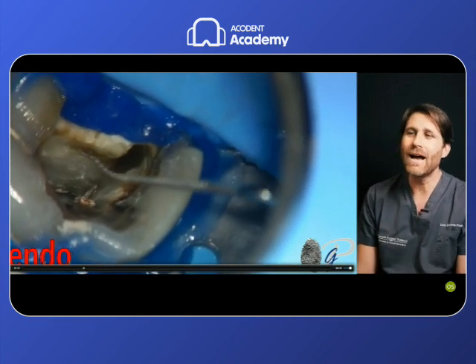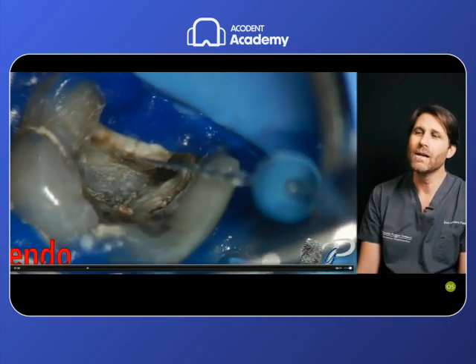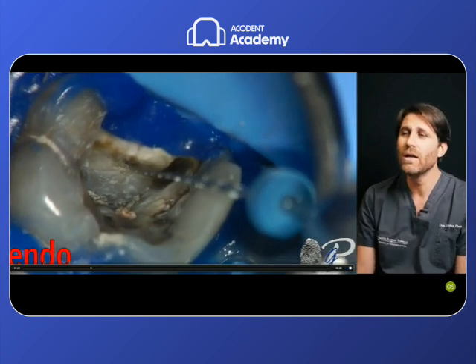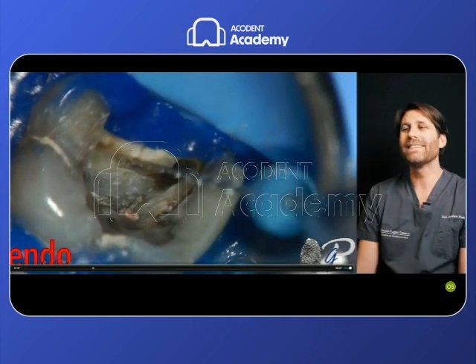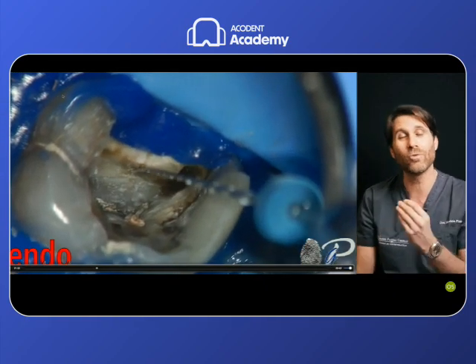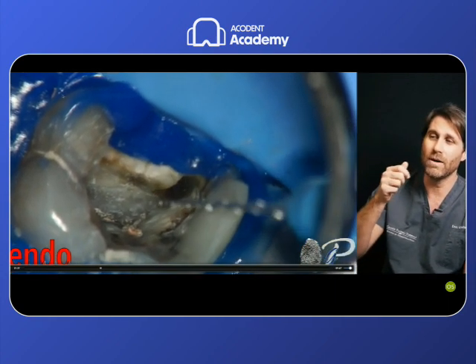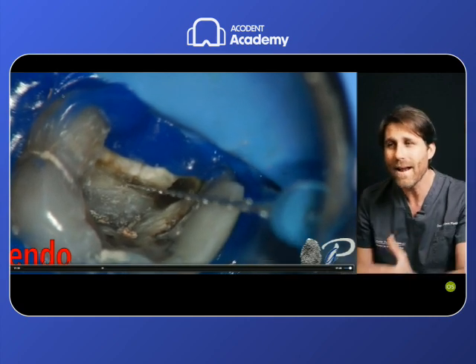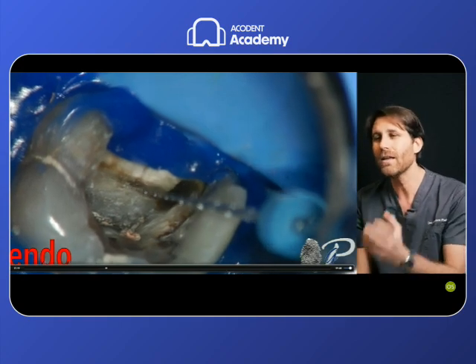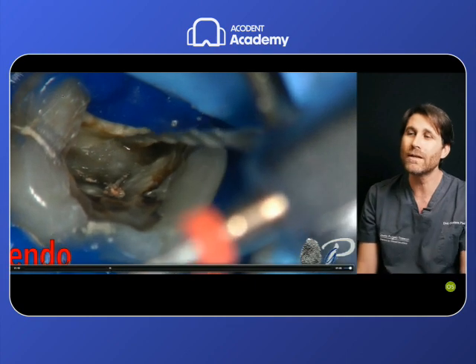Hand files don't work at all in these cases. They don't penetrate even 1 millimeter. So again, the orifice is there. I have identified it. Again, I tried with the small reciprocating glide path file, but again, this tip is too small. It does not withstand my axial pressure to try to penetrate this anatomy. So I'm pushing a bit on the instrument, performing an axial pressure, trying to penetrate this orifice, to engage the first blade of the instrument to cut and to remove this dentin that would permit the instrument to advance even more. So I took a different file.